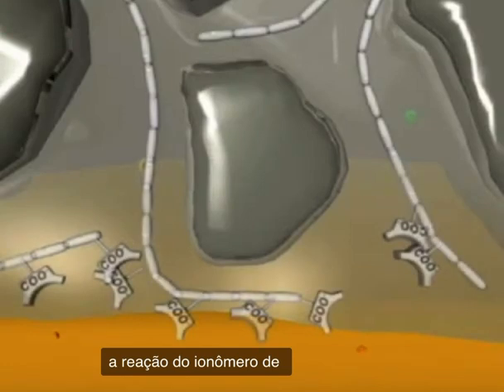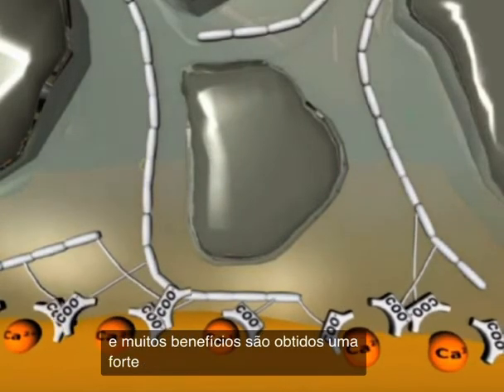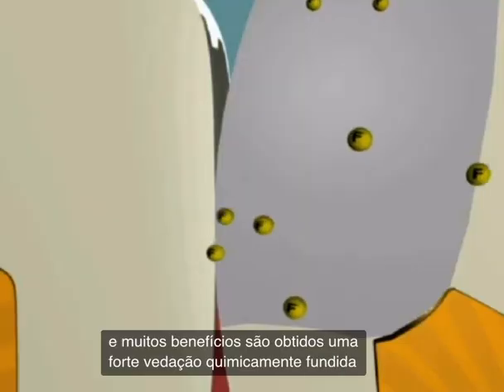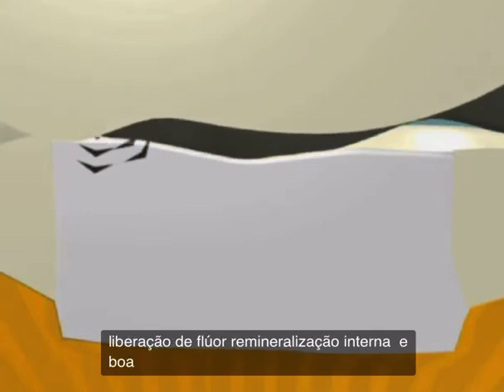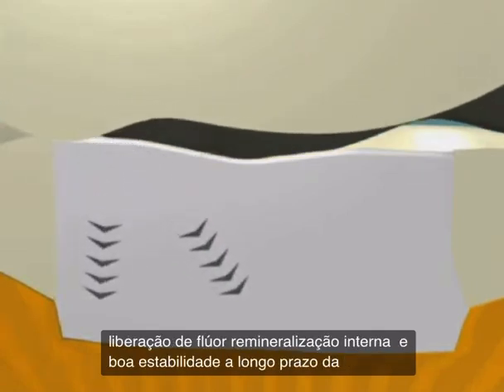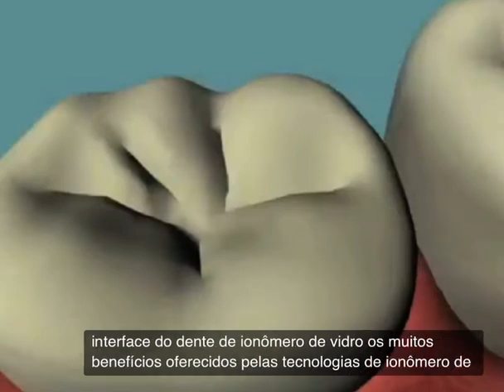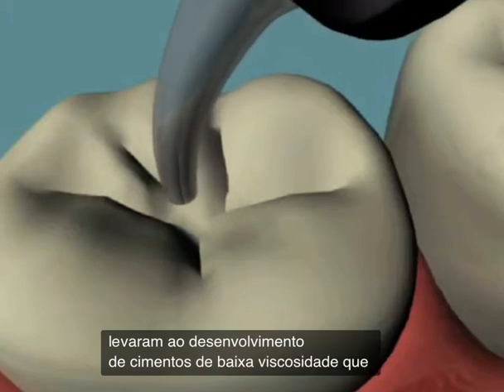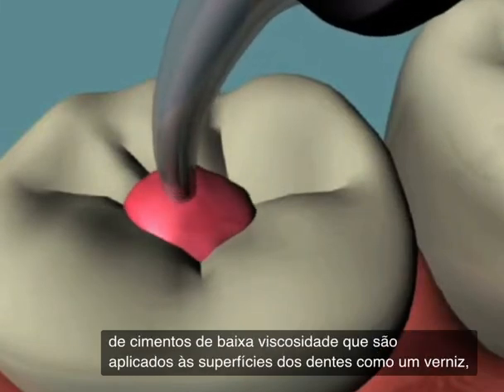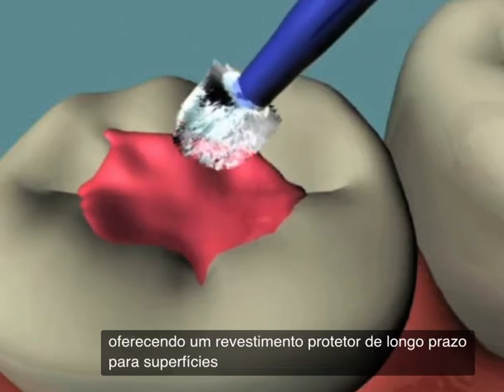The glass ionomer reaction is a complex one, and many benefits are obtained. A strong chemically fused seal, fluoride release, internal remineralization, and good long-term stability of the glass ionomer tooth interface. The many benefits offered by glass ionomer technologies have led to the development of low-viscosity cements, which are applied to tooth surfaces like a varnish, offering a long-term protective coating for surfaces at risk.